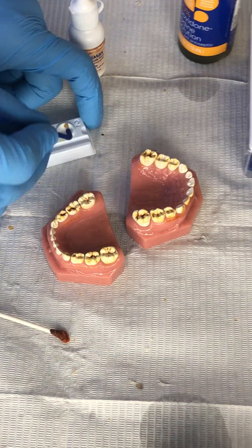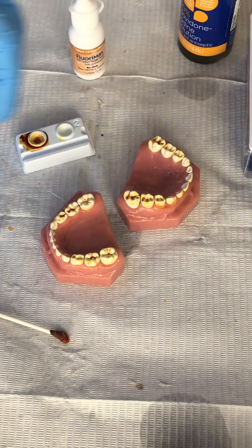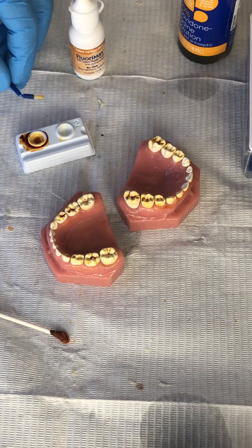Let's not forget the anteriors. Really complicated, isn't it? That's it.